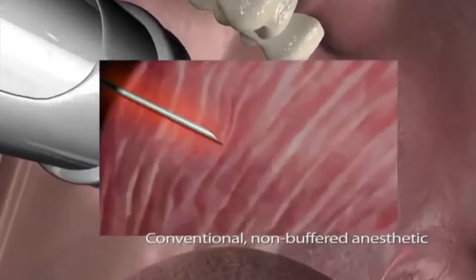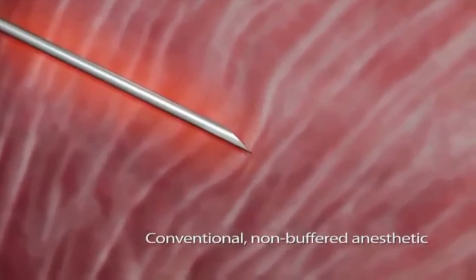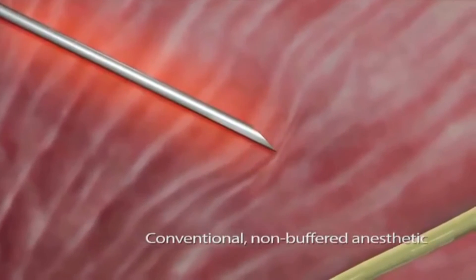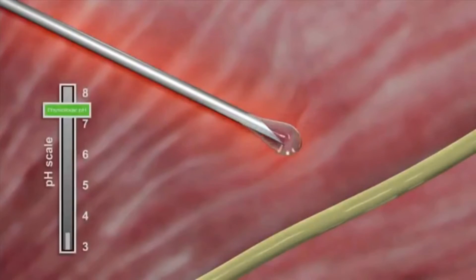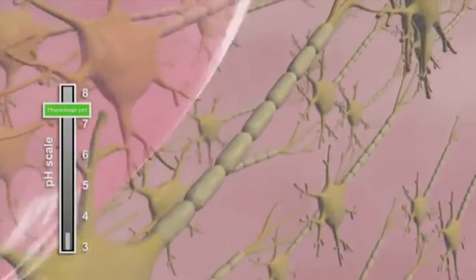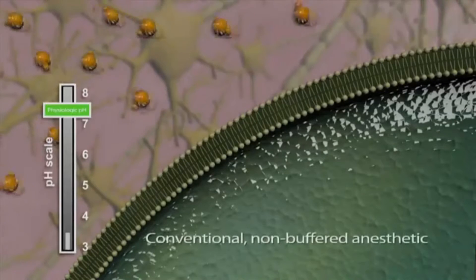Inherently more acidic than body tissue, anesthetics such as lidocaine with epinephrine typically burn and sting during injection and can cause lingering pain for several days due to tissue damage. At a low pH of 3.5, the amount of lipid-soluble anesthetic that can pass through the nerve membrane is 1 in every 25,000 molecules, or essentially 0.